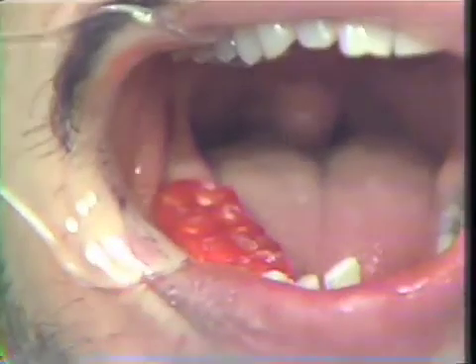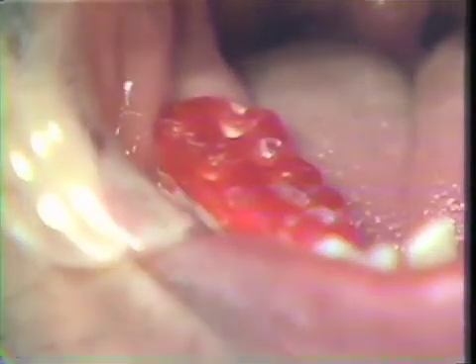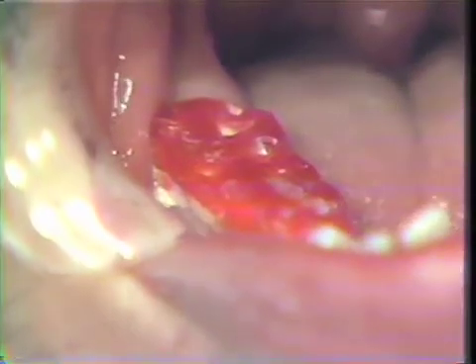Now chew as if you had a piece of food in there, just chew together, fine. Very good. Open again please, fine. We have now captured our dynamic movements in the wax in a static registration. We will now endeavor to register this in stone to give ourselves a stone key.